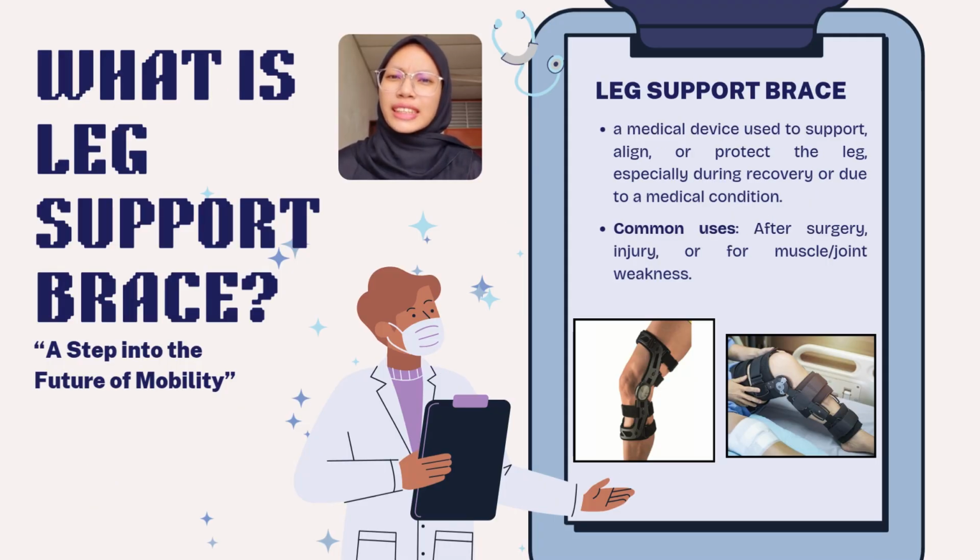Have you ever seen someone walking just a little slower than everyone else? Not because they are lazy, but because every step requires effort and also balance. For many people who are recovering from injuries, surgeries, or dealing with muscle weakness, walking is no longer a reflex. It's a challenge, and this is where leg brace support silently steps in.